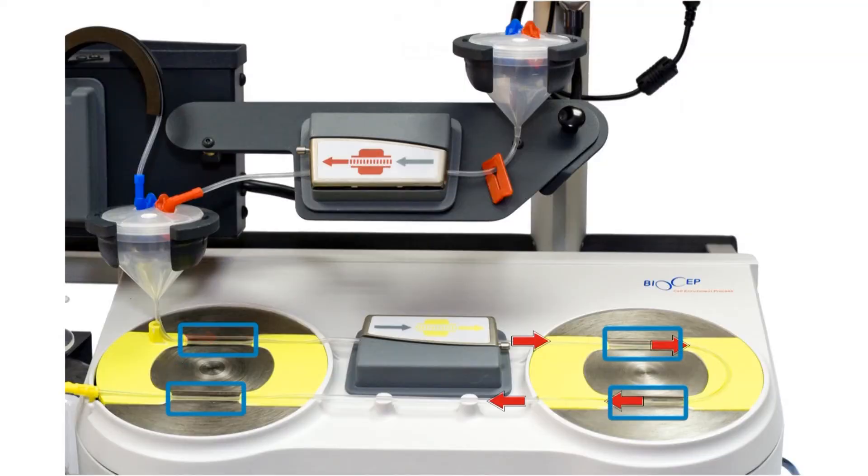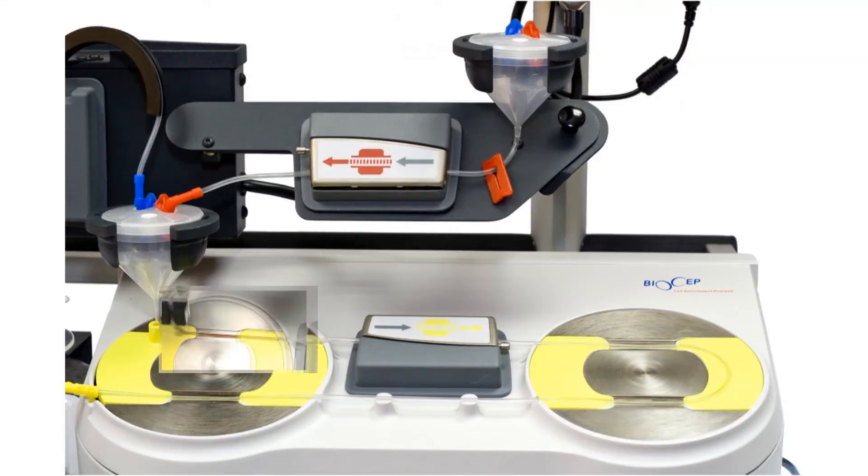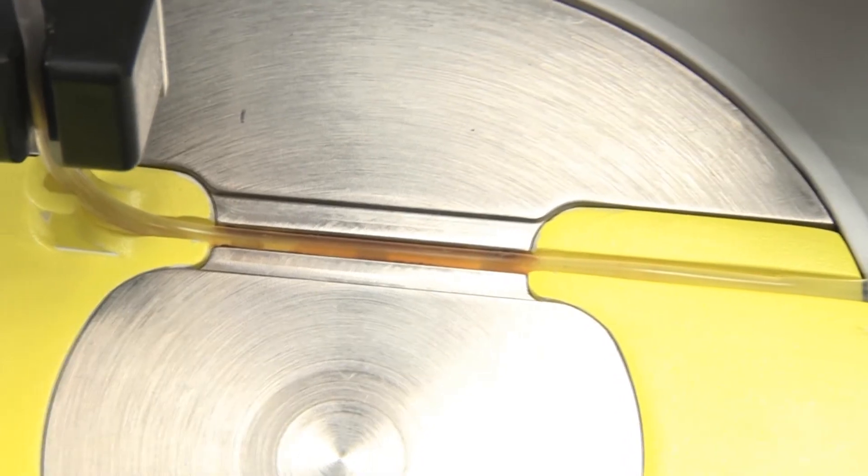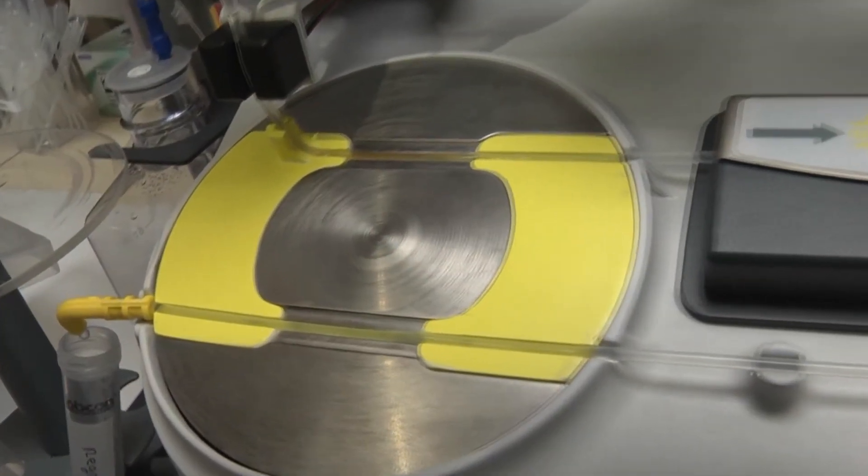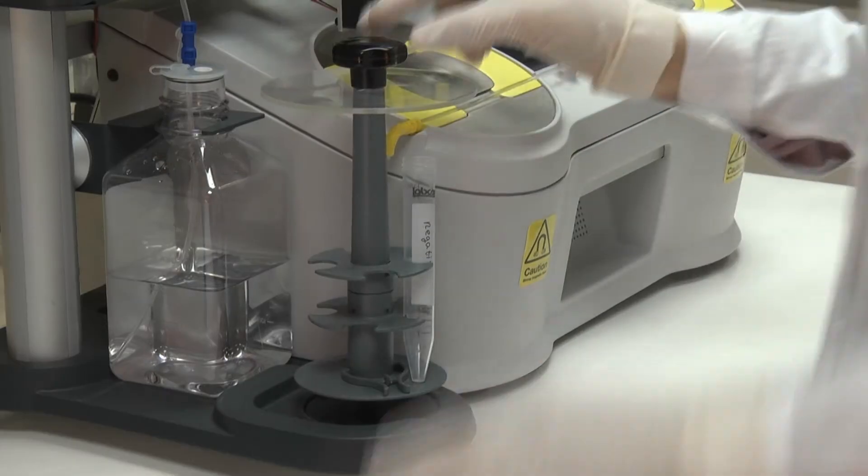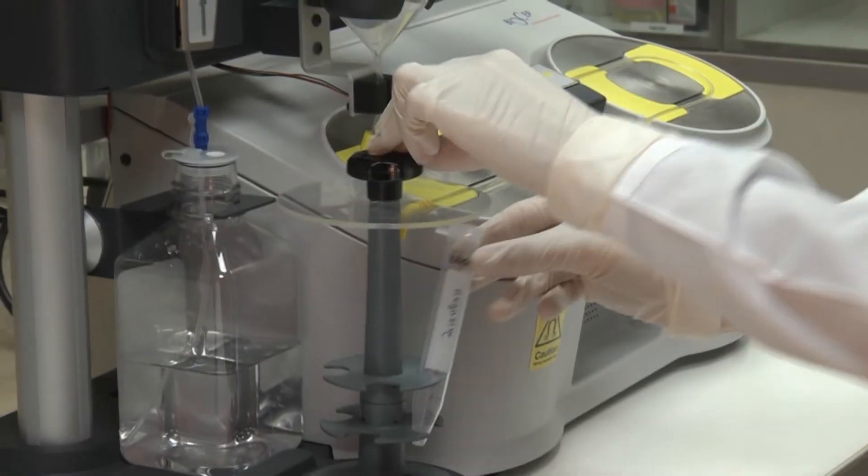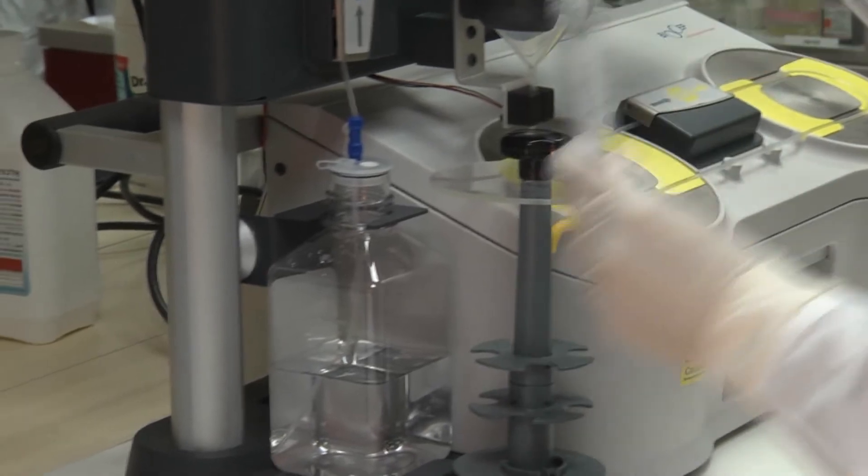The specimen flows through the system, with the immunomagnetically tagged cells remaining in stasis in one of the four isolation areas, until the entire specimen has passed through the system. Isolation is both simple and quick, typically 15 minutes from start to finish.